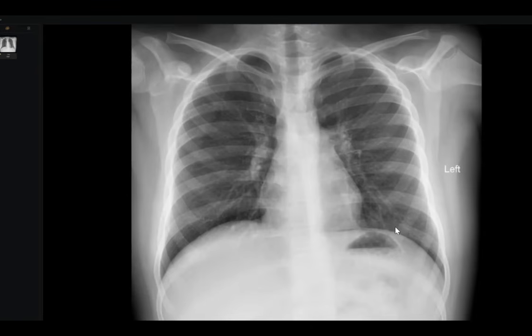Next step, you will talk about the bones and pneumothorax like this, and you will ask, number one, to do an ultrasound because the patient is still in your radiology department. Ultrasound to rule out any free fluid or any solid organ laceration. Number two, I will tell immediately, urgently, the surgical team and recommend CT abdomen.